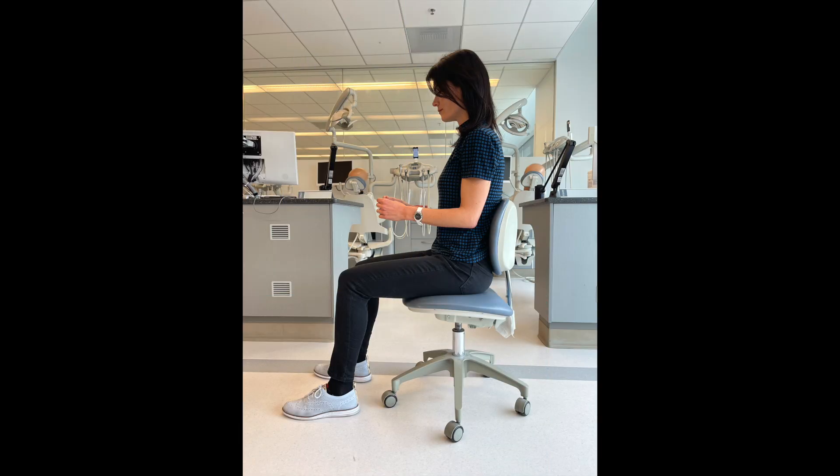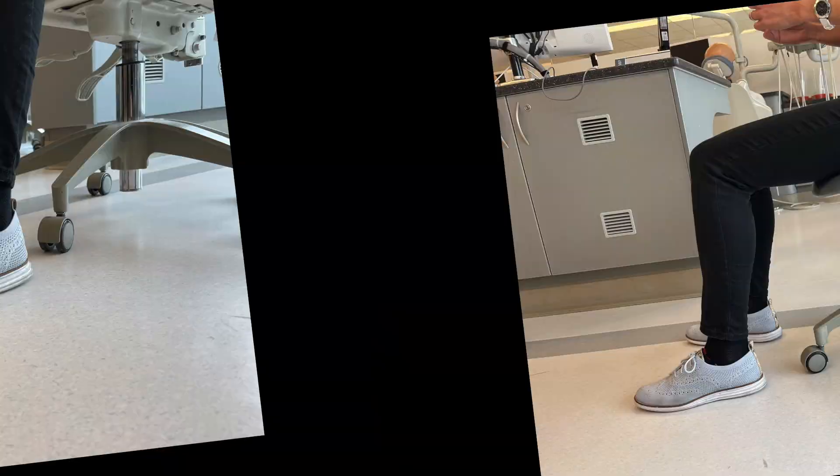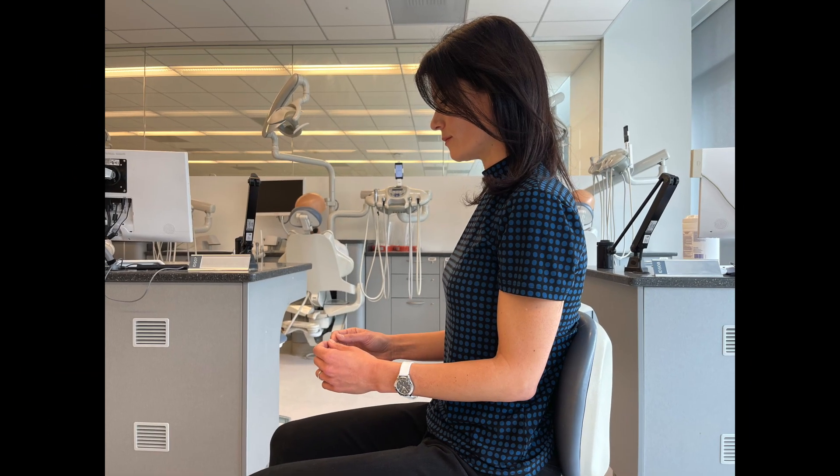Dental working distance. Step one: sit in an adjustable chair as if you were working on a patient. It's important to sit in an ideal posture as this is the posture you will be using when wearing the loops — feet flat on the floor, thighs parallel to the floor, straight back, arms at a 90-degree angle, elbows close to the body.